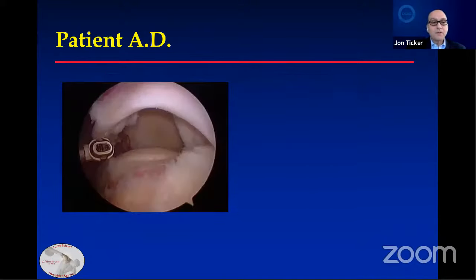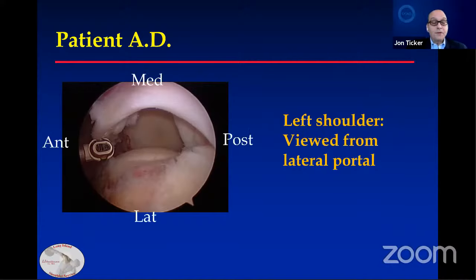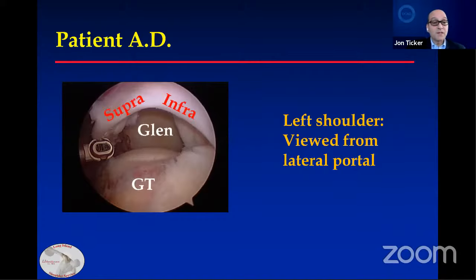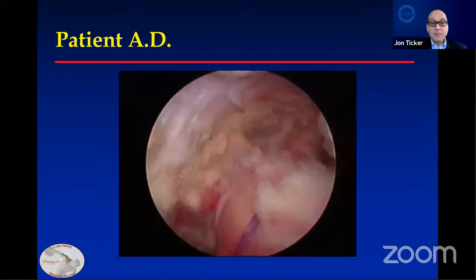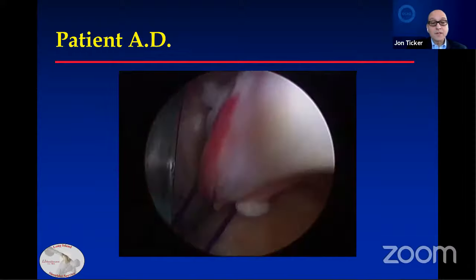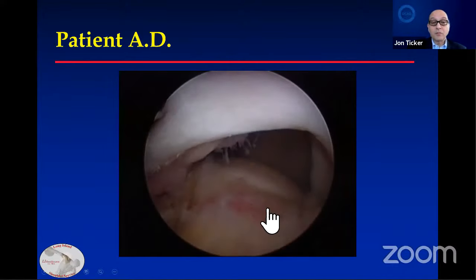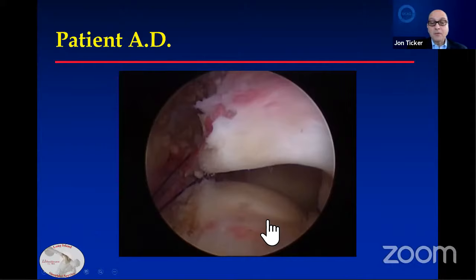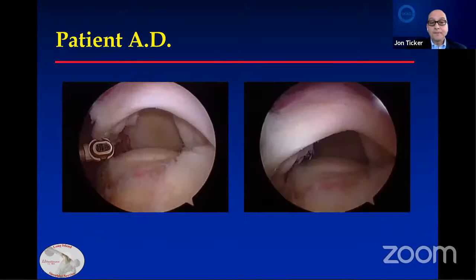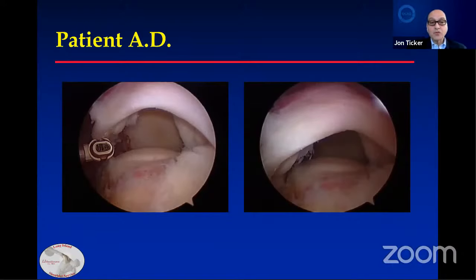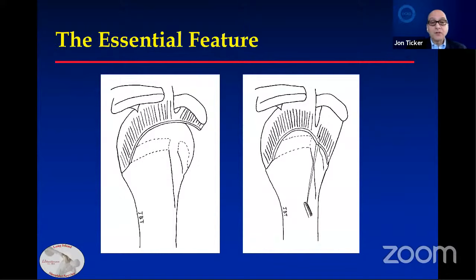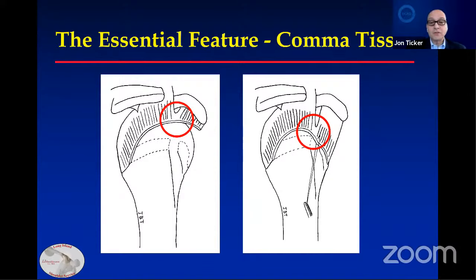Viewing the same patient through the lateral portal — anteriorly on the left — with the glenoid, greater tuberosity, supraspinatus, and infraspinatus. If we pull the subscapularis, we'll see the tendon come over the lesser tuberosity and bring the posterior superior cuff more laterally. That's going to help me with my repair. Before and after — I'm able to get a much more secure repair. The essential feature is that confluence between the subscapularis and the supraspinatus called the comma tissue.